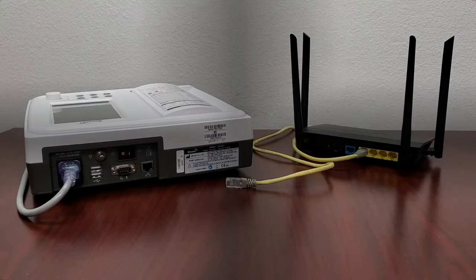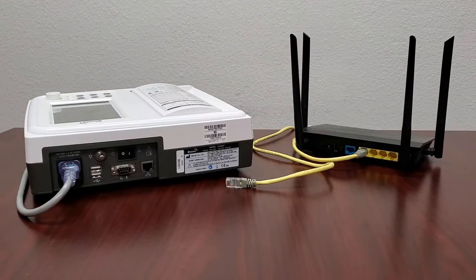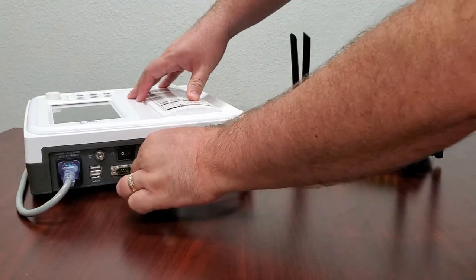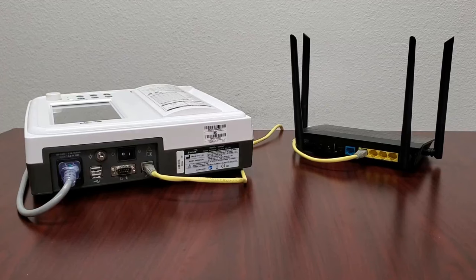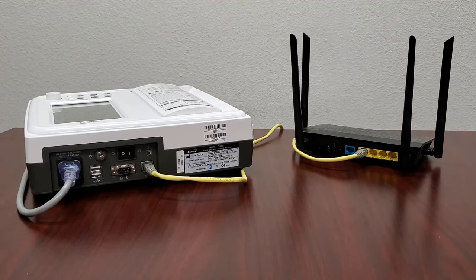Moving on to the Cardio 7, there are multiple ways to connect it. Let's begin with a wired connection. Connect your Cardio 7 to your internet router using an Ethernet cable. Ensure that the router you use is the same one providing a network connection to your computer with BMS Plus, as they will both need to be on the same network to communicate.